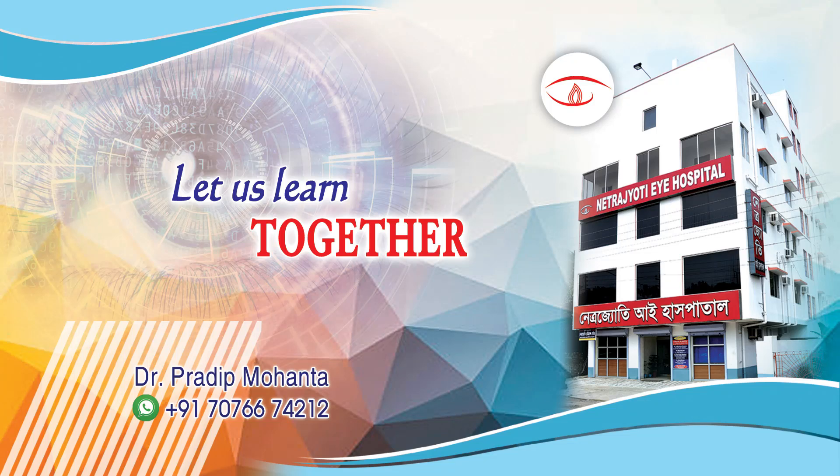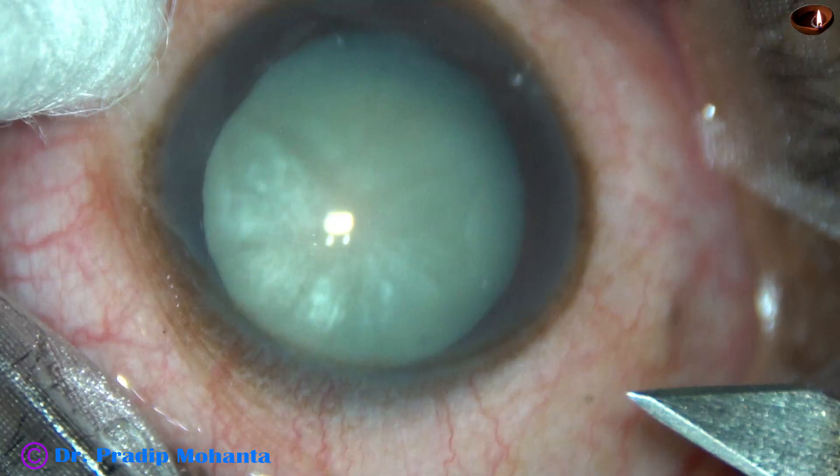Friends, welcome to my workplace at Rana Ghat, West Bengal, India. Let us observe phaco-emulsification of this white cataract.